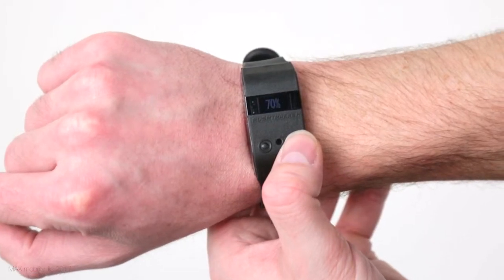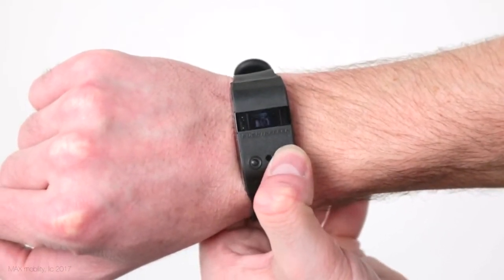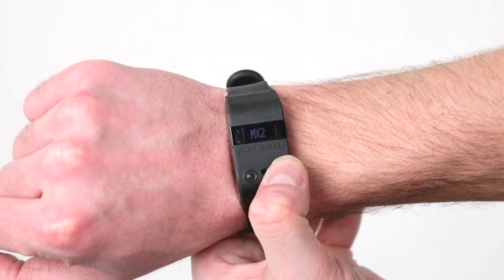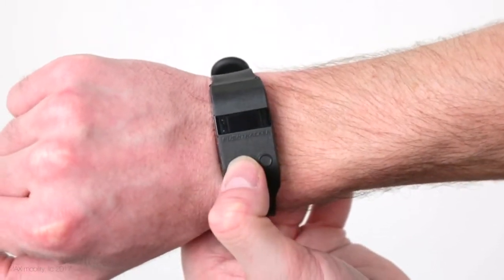In addition to changing the max speed, which defaults to 70% or 4 miles per hour, 6 kilometers per hour, you are able to change the acceleration or speed ramp rate of the SmartDrive, the tap sensitivity of the PushTracker, and the control mode. While we do offer multiple control modes, the MX2 Plus is the latest and hands down best, so you will want to use that one. Also, it is a bit easier to make all these changes in the app, so be sure to download it and check out the other additional features it has. Finally, use the exit icon to get back to the settings menu, or you can wait until it automatically times out.